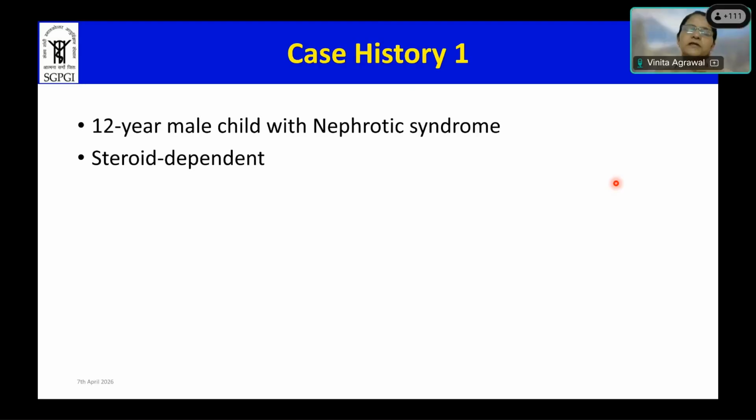Right. Absolutely. So generally, when we look at a renal biopsy, we talk about 7 glomeruli. Ideally, you should have at least 7 glomeruli in a renal biopsy to say that it is adequate. I'm talking basically about native renal biopsies today. Having said that, it doesn't mean that if you have a biopsy which does not have 7 glomeruli, you just say it is inadequate. Try to look at whatever glomeruli are seen. Sometimes you can make a diagnosis even with 1 glomerulus.